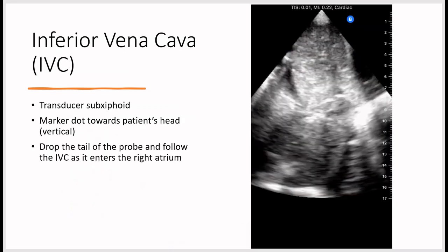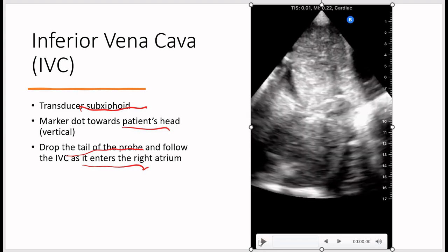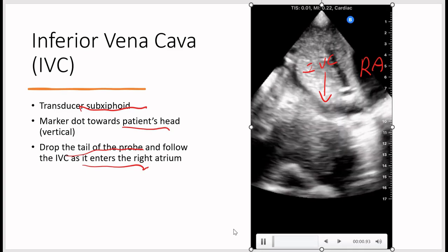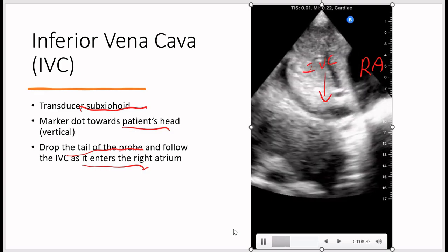To get the IVC view from the subcostal position, rotate the probe marker counterclockwise 90 degrees and raise the probe slightly to achieve a roughly perpendicular angle to the patient's skin. The marker points toward the patient's head and you drop the tail of the probe, following the IVC as it enters the right atrium.